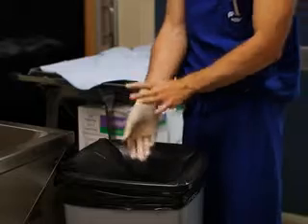Discard the gloves, wash your hands again, and put on the gown and a new pair of sterile gloves. Drape the patient, exposing only the cleaned forearm from the wrist to the antecubital fossa.